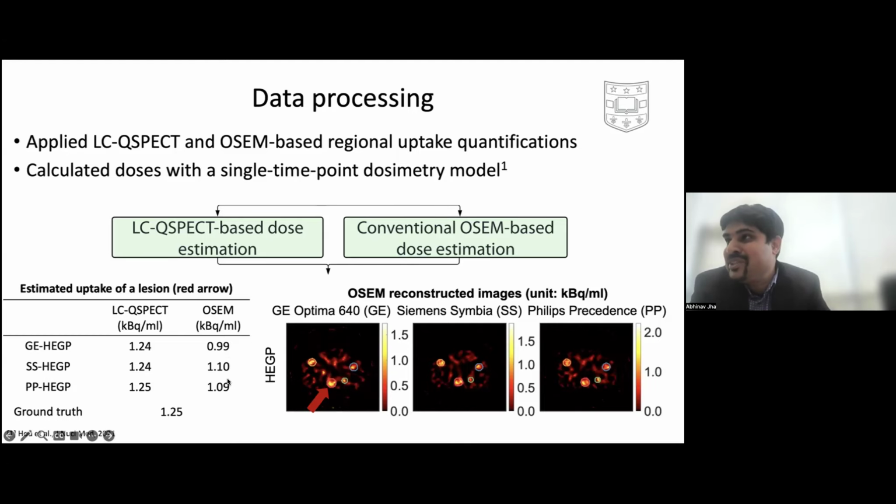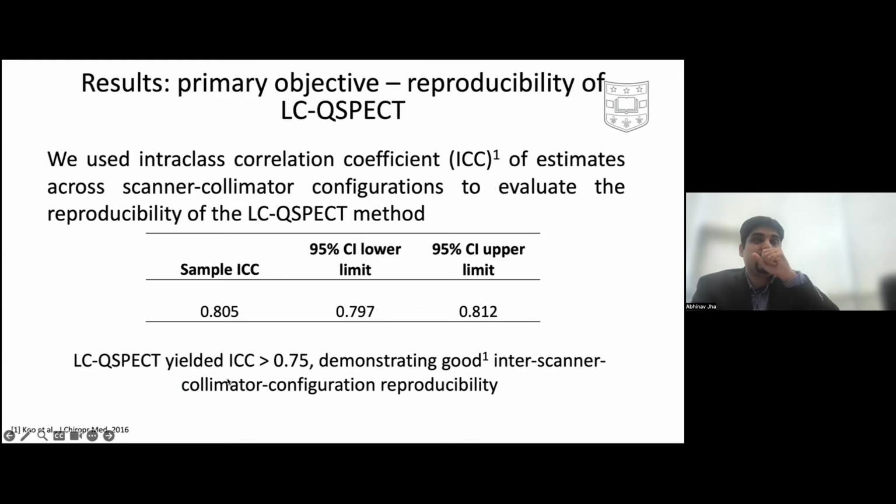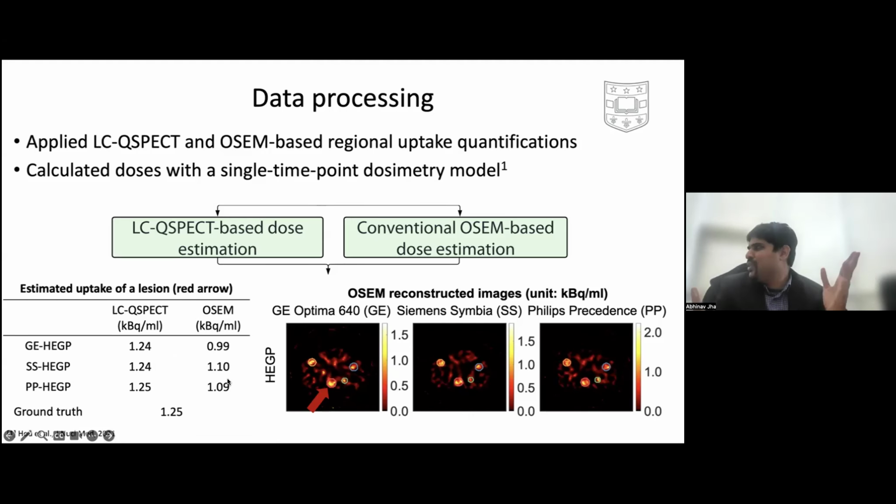But this is just one patient, and never make inferences from one patient. You have to look at your population, right? Because you never know. It's just a sampling error, really. Why are you showing us just a single patient? Just to give you a representative case, not to convince anyone. Just to give you a visual feel in some sense. You can see that there's variability here, right?